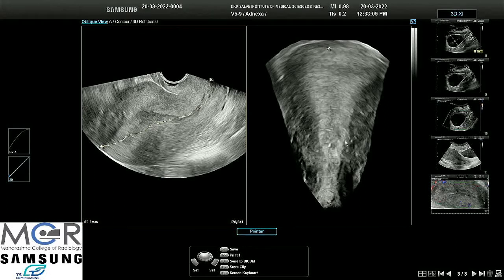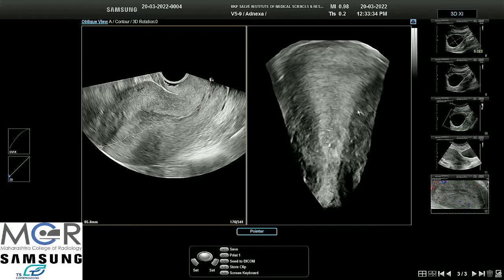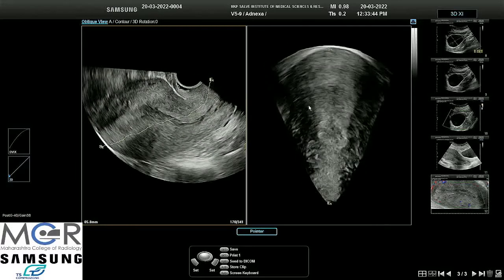This is a 3D of this uterus. The endometrium is not distinct — there is ill-defined endometrium at some places, and there is a loss of the endo-myometrial junction. Here it is clear, but here this is the place where there is an area of adenomyosis.